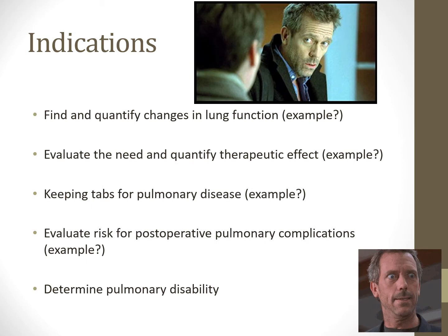So when we're looking at indications, we need to quantify, right? Get a numerical measurable value. That's what we're talking about. Quantify means we get a number and a measurable value, right? It's not subjective, it's objective. So we need to quantify changes in their lung function, right? So what would be an example of this?